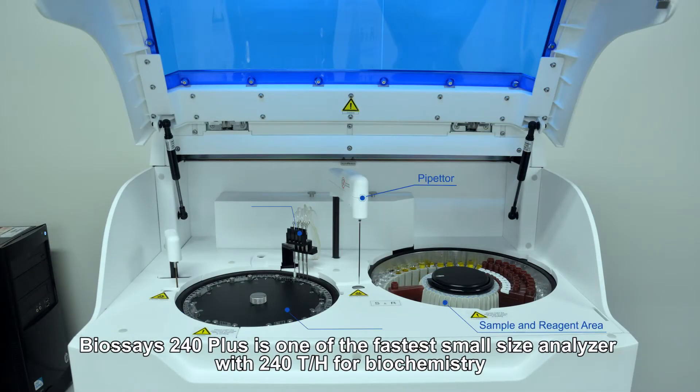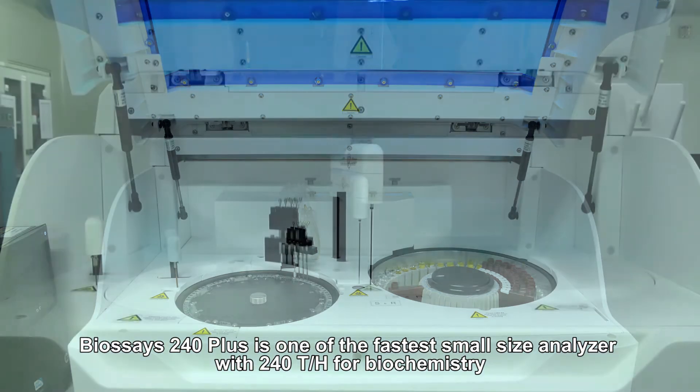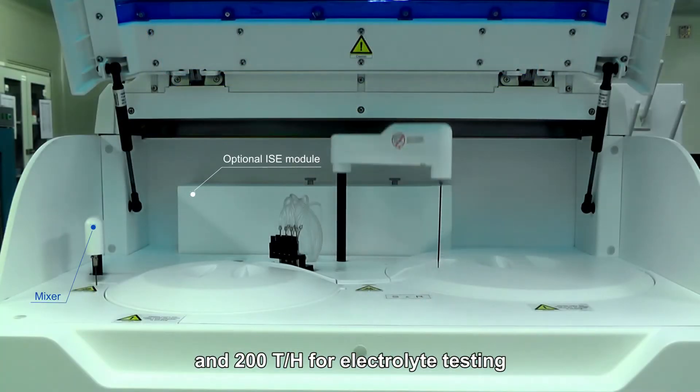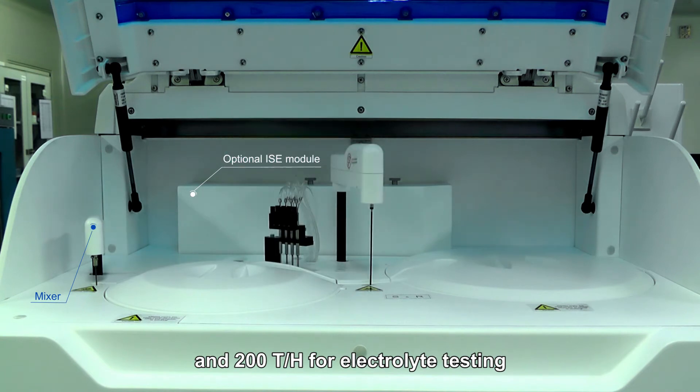BioSays 240 Plus is one of the fastest small size analyzers with 240 tests per hour for biochemistry and 200 tests per hour for electrolyte testing.